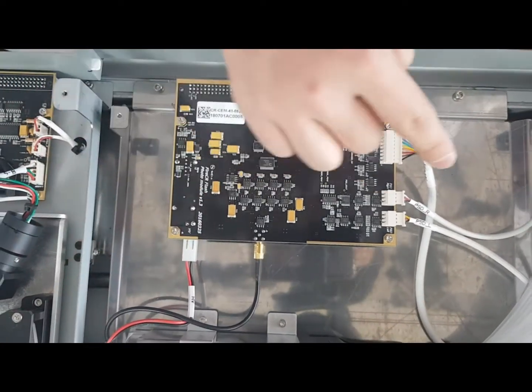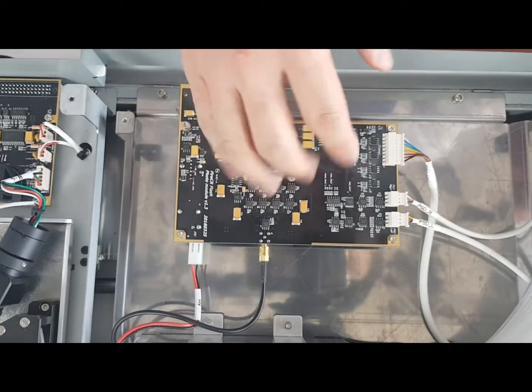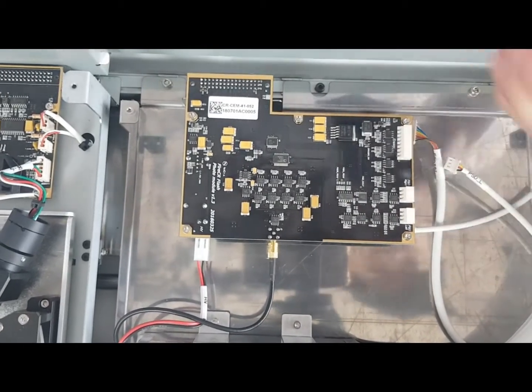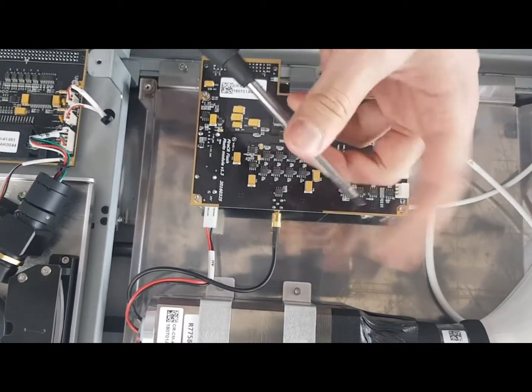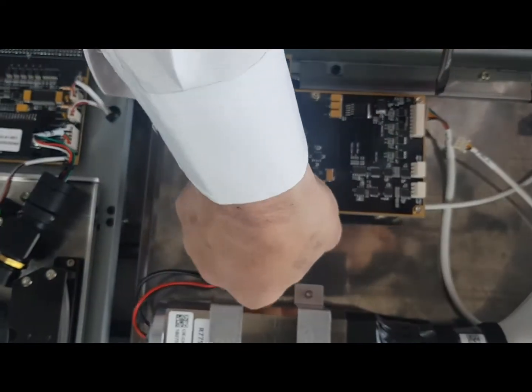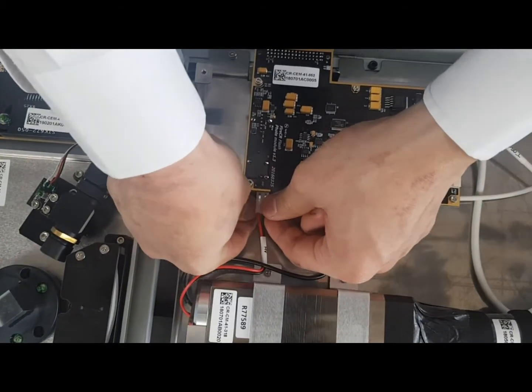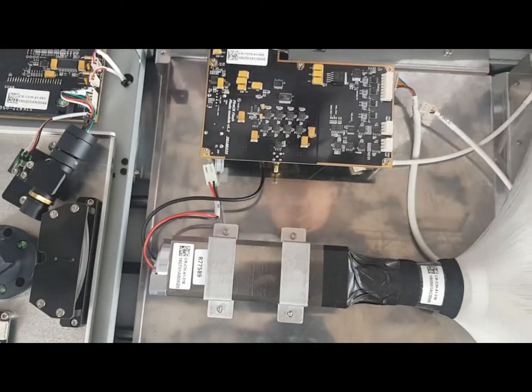To remove the photo module, you have to remove the five cables and then five screws using a 2.5 hex key. First, remove the cables. My tip is to use this kind of driver and then just push it outwards. For this one, you first have to push the bottom part down and then pull it outwards.